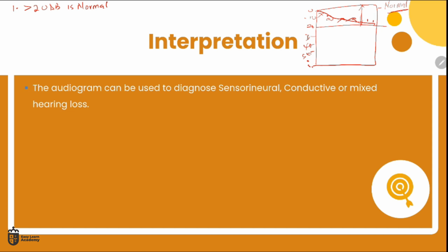The second point, which everybody needs to know when it comes to the audiogram, is how do we know it is sensorineural deafness, SND. So sensorineural deafness is simply when air and bone are affected. And we'll look at it shortly. Don't worry about what is air, what is bone, but worry about the principles, because if you do not understand the principles, then you will struggle.